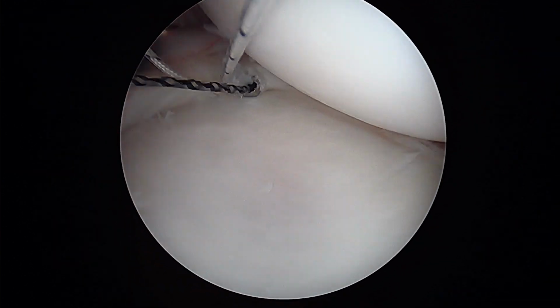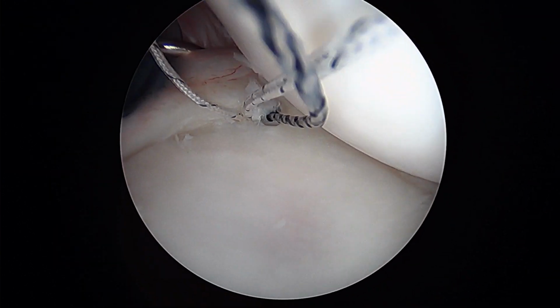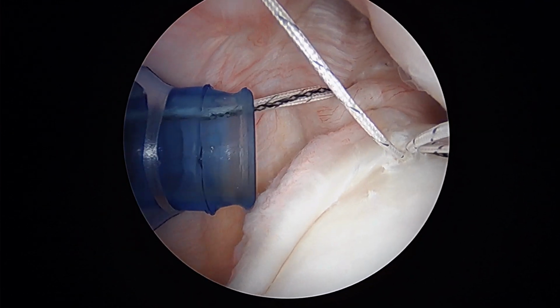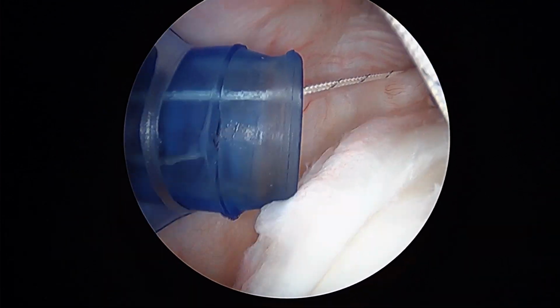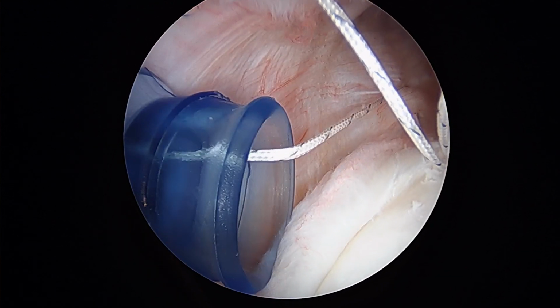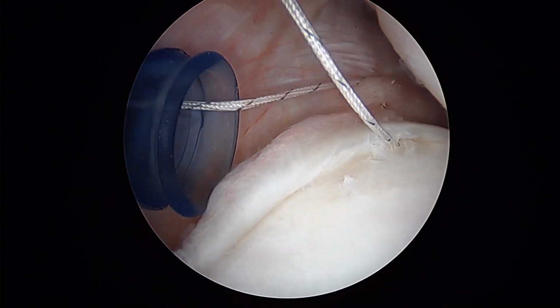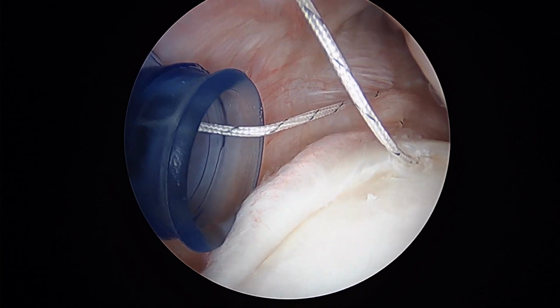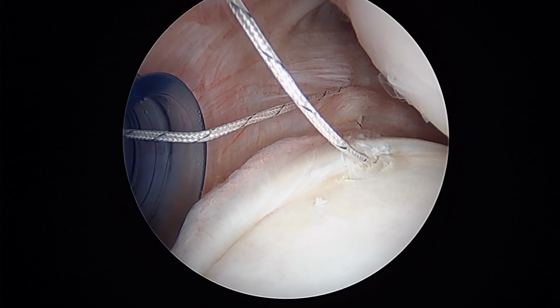So we'll go ahead and feed the relay. We're going to retrieve that and shuttle the suture. Okay, as we pull back, you can see how the black wire is actually pulling that blue and white striped suture, and as we pull tight, you'll see that go all the way underneath. And now I'm going to do a special type of mattress stitch. It's called a figure 8 because I think it's a little bit stronger.